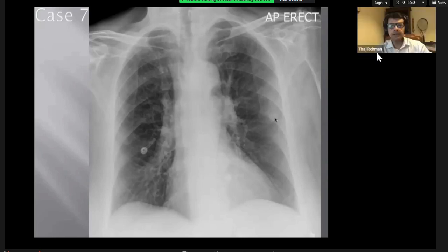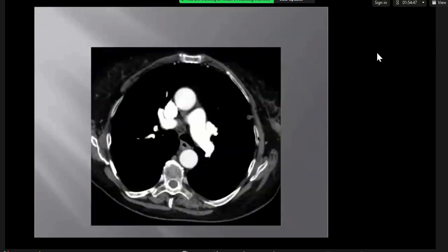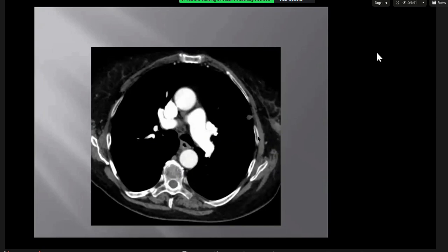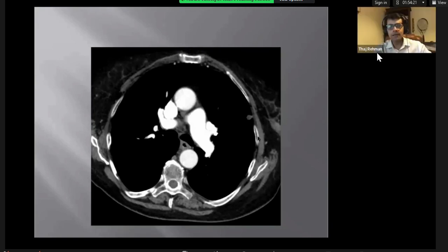And what do you do next now? So in this patient, I would closely examine the lesion to check if it has any special features. But in my normal practice, this patient will usually get a CT scan, which I give you now. So I can see a peripheral subpleural nodule. I think there is a small hypodense core within the lesion. It's a single cut. That's all that's needed to make the diagnosis.